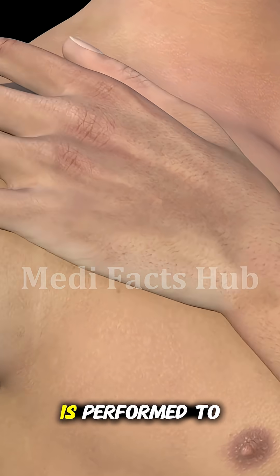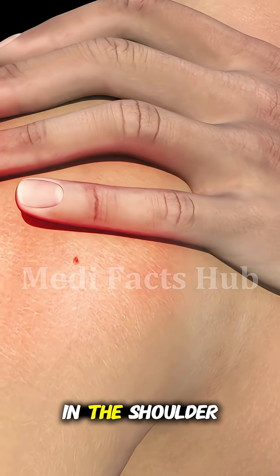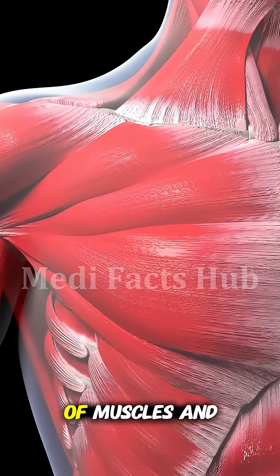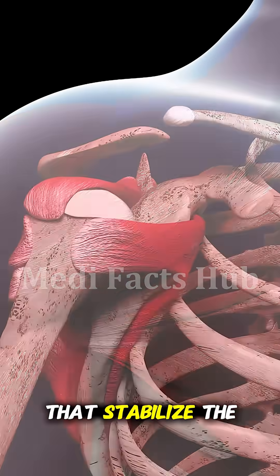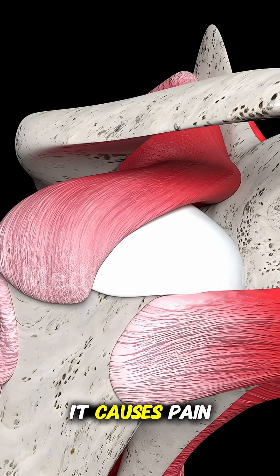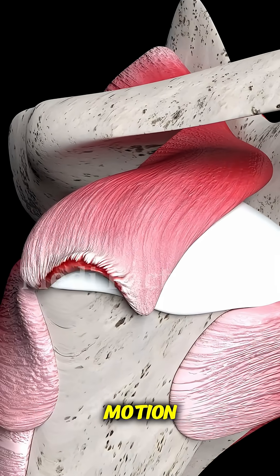Rotator cuff repair surgery is performed to fix torn tendons in the shoulder that help lift and rotate your arm. The rotator cuff is a group of muscles and tendons that stabilize the shoulder joint, and when it's torn from injury or overuse, it causes pain, weakness, and limited motion.